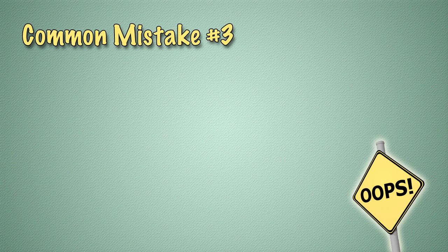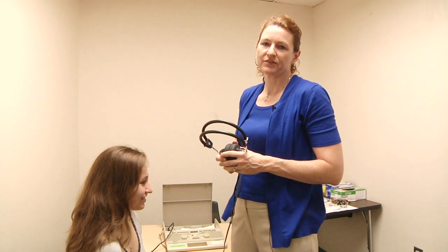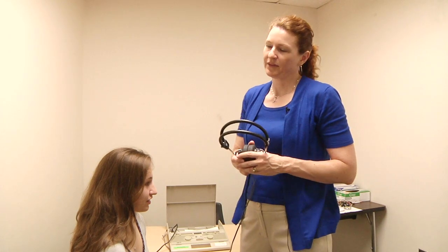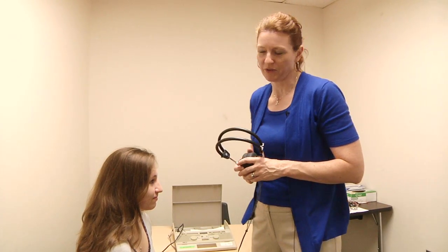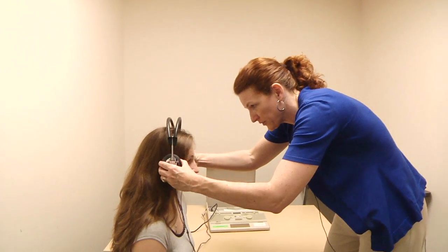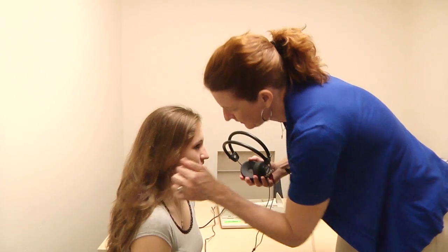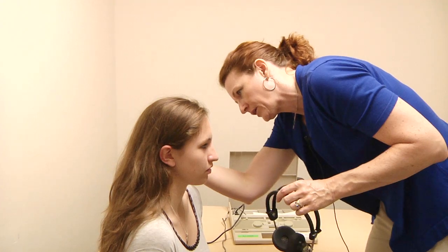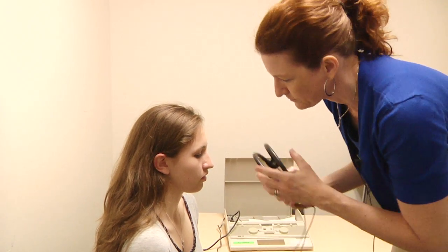Common mistake number 3, improperly placed earphones. Over the past 17 years, I've trained a lot of students to do hearing testing. And some of the things that they do the first couple of times that they place earphones are a little crazy, so I'm going to show you those and tell you how to avoid the mistakes. I have seen students place earphones on top of hair, and that's not okay. I'm going to place the hair gently behind the ear before we go ahead and place the earphones. Also, if they're wearing large or bulky earrings, you want to ask them to take them off.